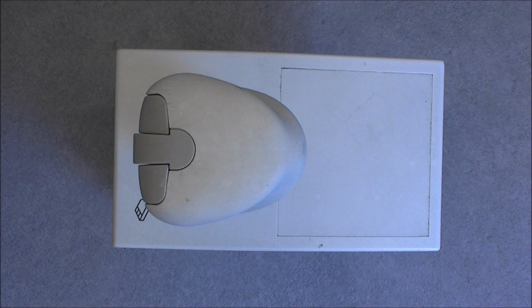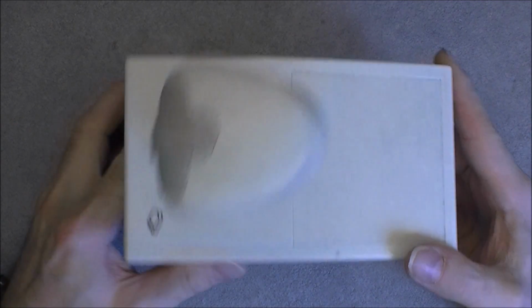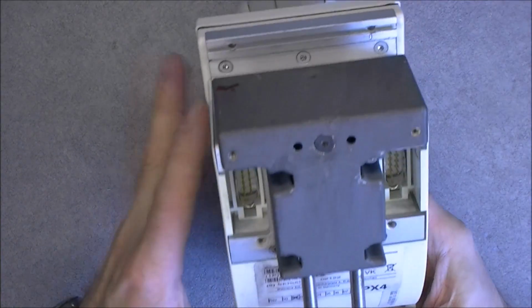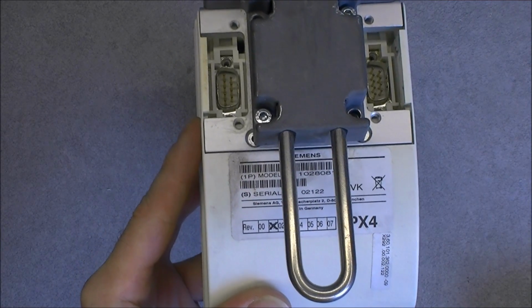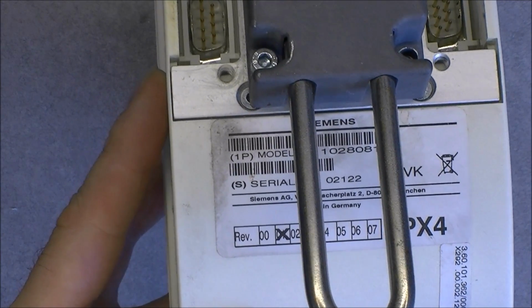Hi guys, today a first teardown of Siemens X-ray controllers. So I picked up randomly this one. It is a mouse controller. I have 3 of them. This one has a $4,000 price tag. Here is on the back the model number for you and the serial number just here under the metal part.